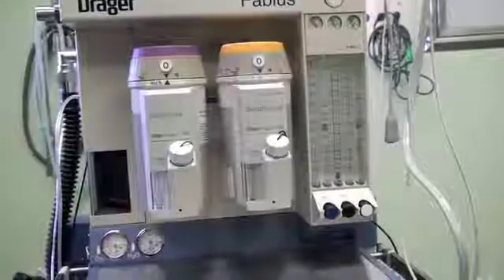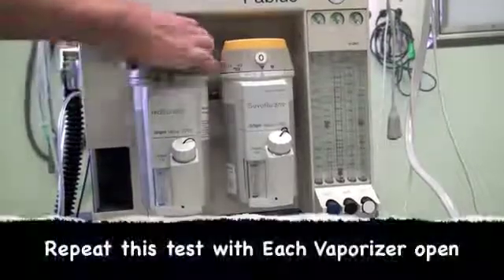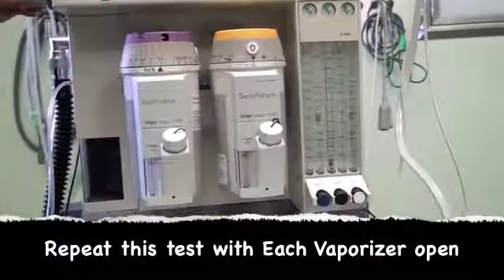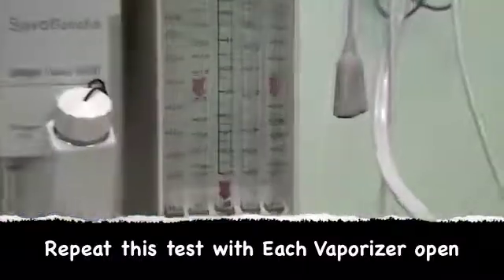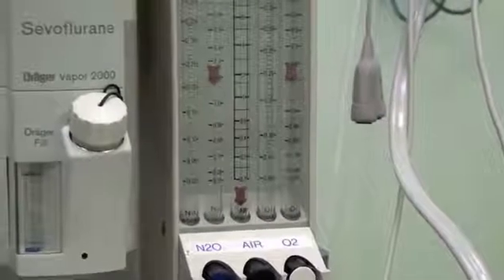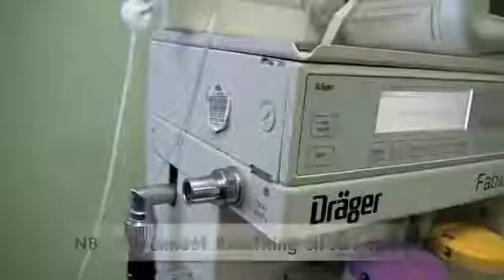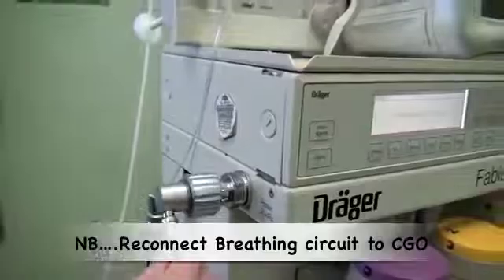Also, while occluding the common gas outlet, one needs to repeat the test with the vaporizers open. Here we can see the bobbins still bounce, and if we listen closely, we can't hear any leaks from around the vaporizer. This is repeated with each vaporizer. Don't forget to reconnect your breathing circuit to the common gas outlet.